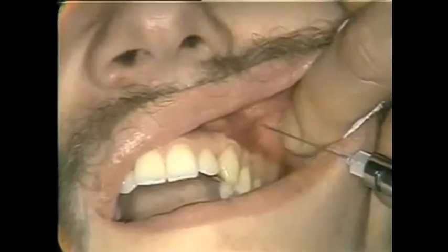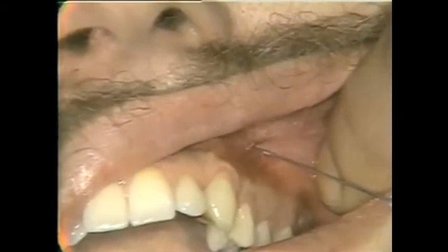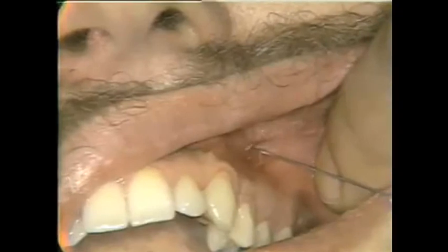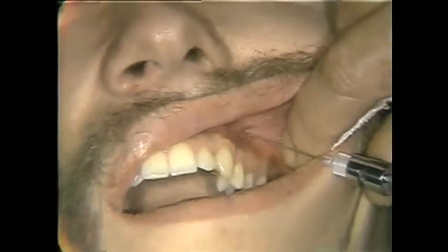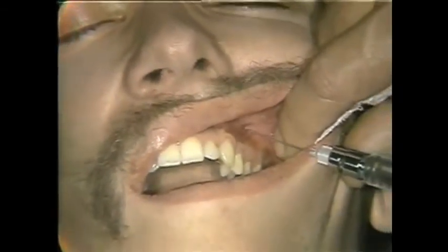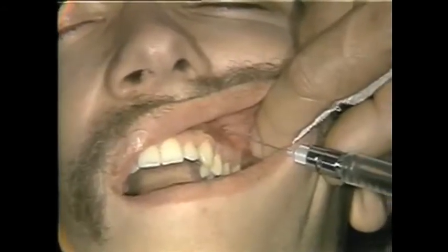Now you can observe again the tight, tense vestibular tissues, and our needle can be very easily passed through them. In fact, on occasion you can bring the lip down and actually pull the vestibular tissues over the needle bevel as you make the penetration. Then the needle bevel is carried quickly to bone. We aspirate and inject a half cc to 0.75 cc of solution, and then out quickly.